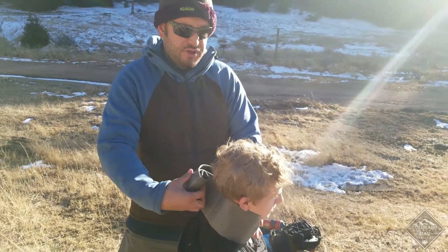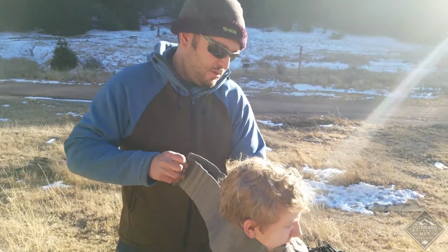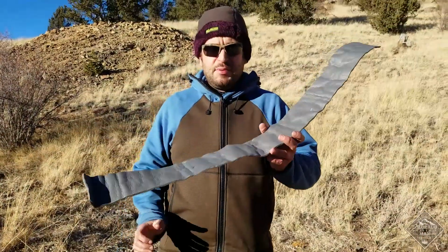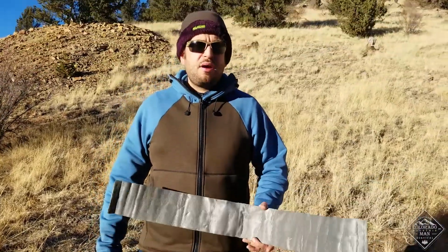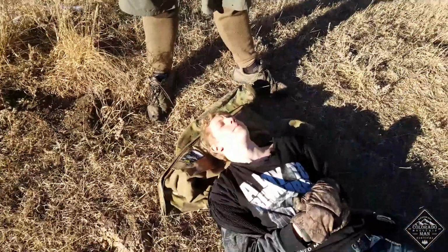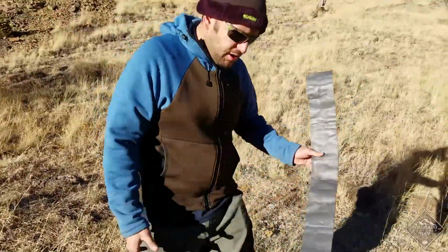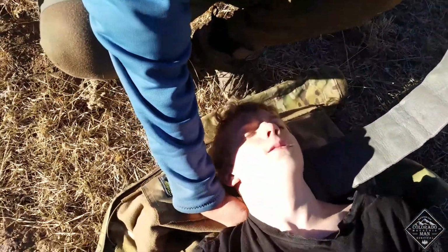So let's focus on doing this same procedure from laying down. Okay, so we've got the SAM splint straightened out again, or as much as we can. Same thing. Post-trauma, we can't rule out cervical injury, so we're going to have to immobilize them. I can't really access it from the front and torque it in the back, so I'm going to slip it around, and I'll show you a little technique here. So this is a great position to be in. He's immobilized. His head's on this just for comfort.